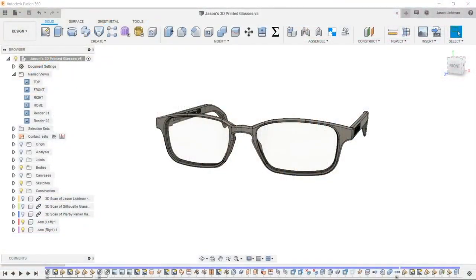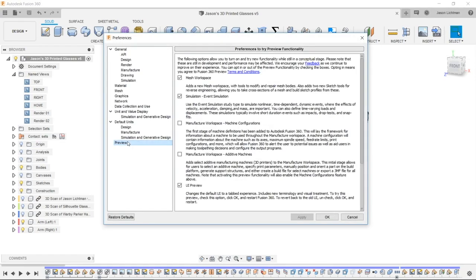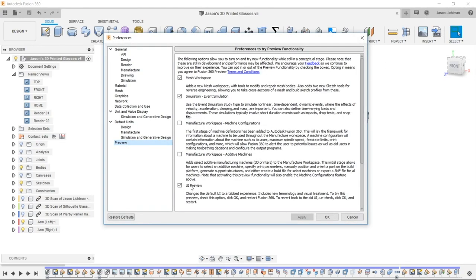Let's jump right into Fusion 360 and walk through this file. On screen right now you can see my Fusion 360 up and running with the new user interface loaded. If your screen does not look like mine, turn on the new UI — you can do so under the top right corner under your name. Click on preferences, then under preview make sure to turn on the UI preview.